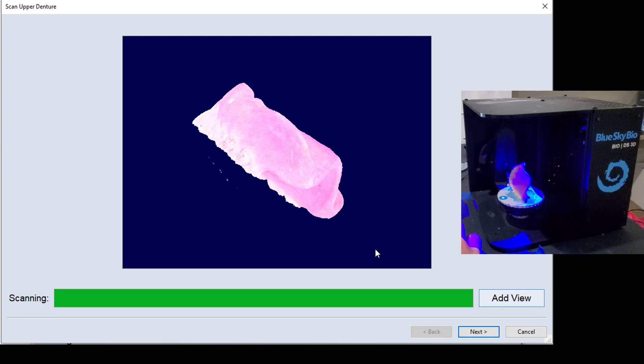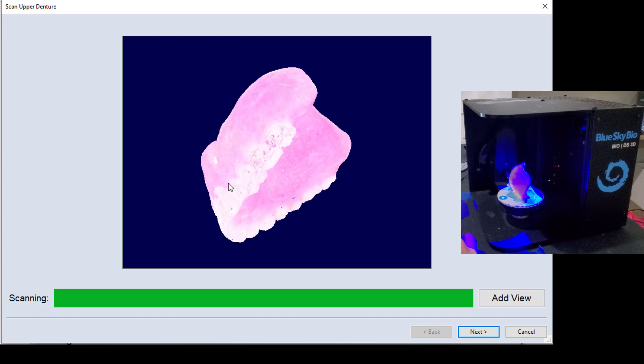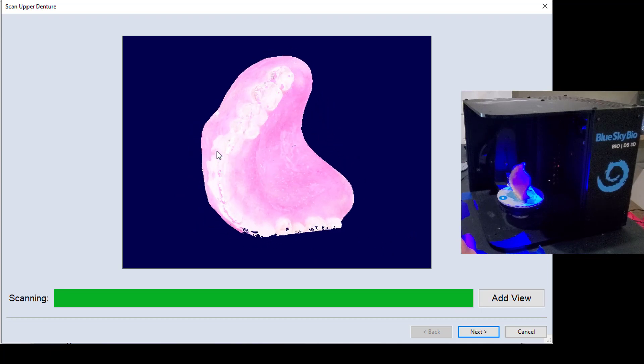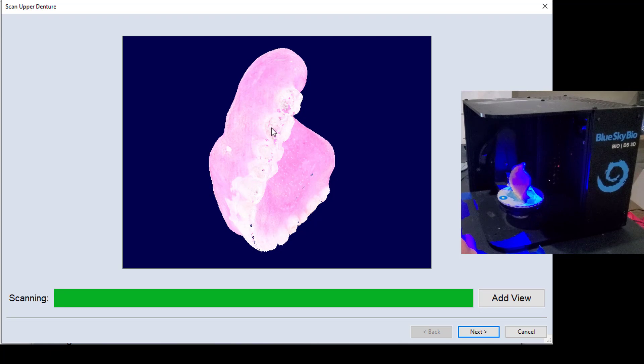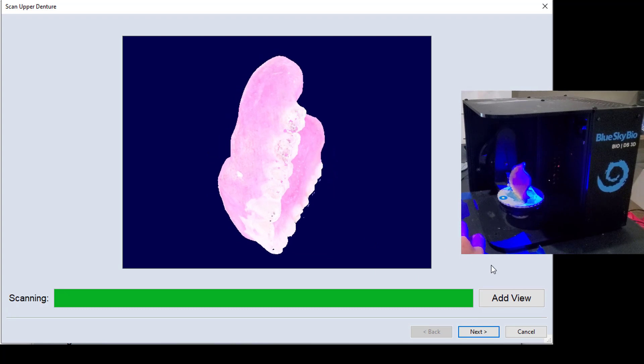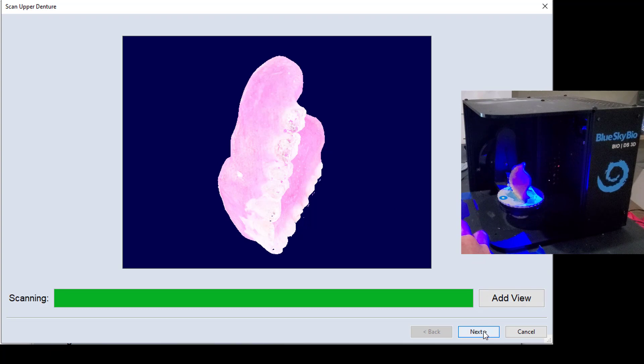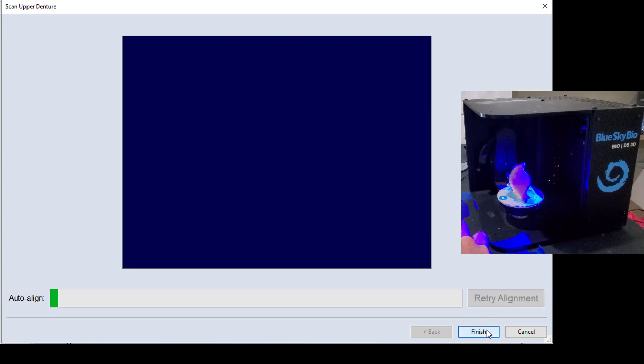So if I wanted to fill in those holes by taking more shots, I could orient it like so, and then hit add view. But again, the little holes that I'm seeing here have no consequence for the duplicate process that I'm trying to do.